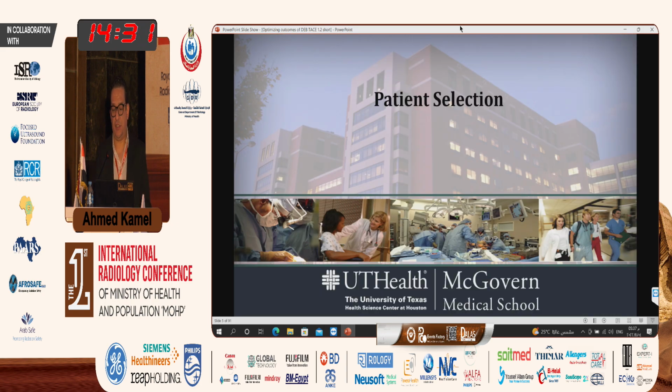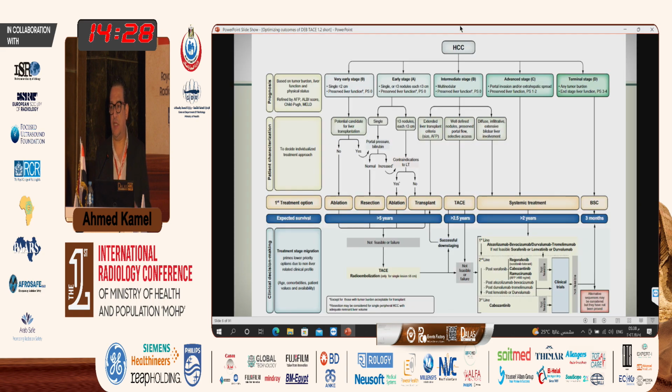So in terms of patient selection, which is, of course, very, very important, you cannot just do TACE for everyone. So TACE is mainly done for BCLC-B. And that's a little bit of an addition to Dr. Ayman Hassan's presentation, is that there's a new BCLC algorithm, which is what you see over here, that was published in 2022. And we all know that the BCLC-B patients, which is the intermediate stage, is a very heterogeneous group of patients.